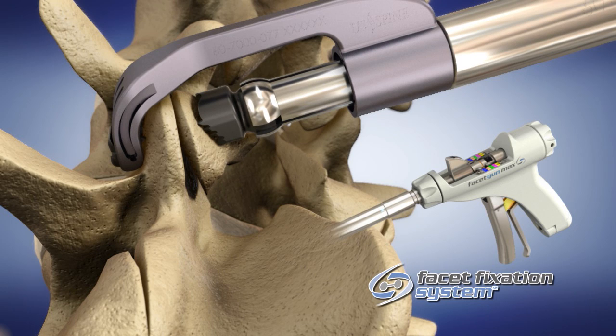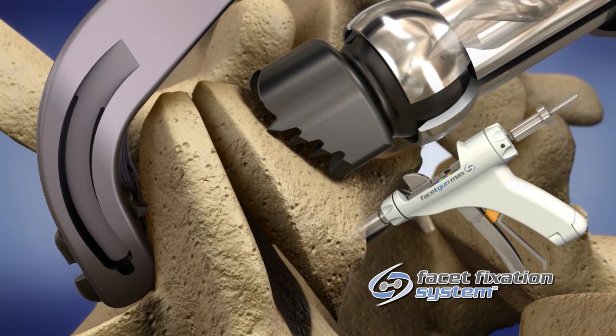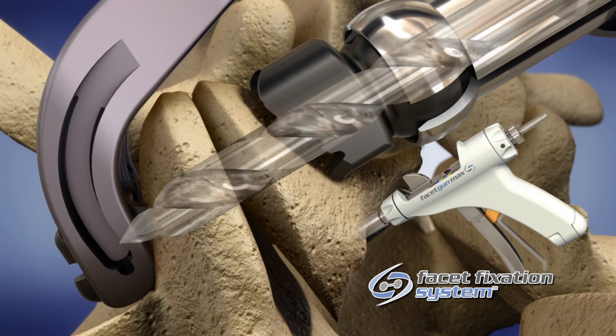determine the proper facet screw length by reading the color-coded indicator located at the top of the handpiece assembly. Each color denotes a different length of facet screw. Insert the drill into the back of the handpiece and drill forward slowly until the hard stop is reached.